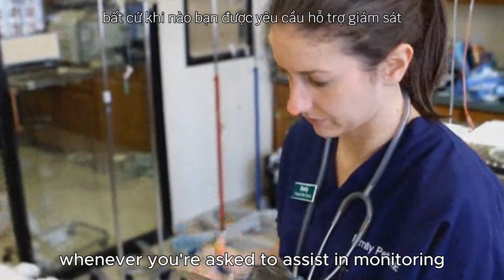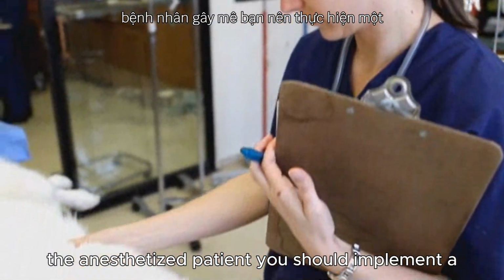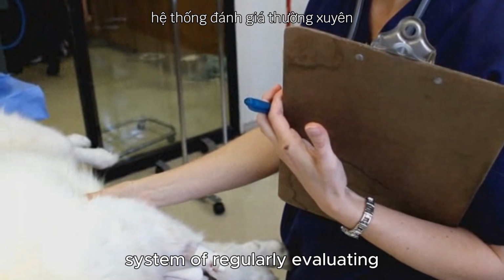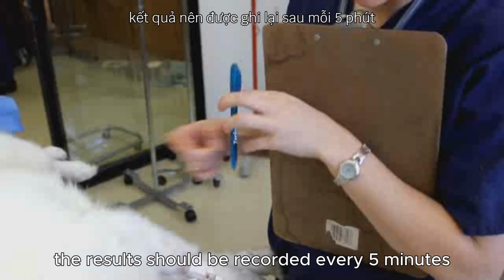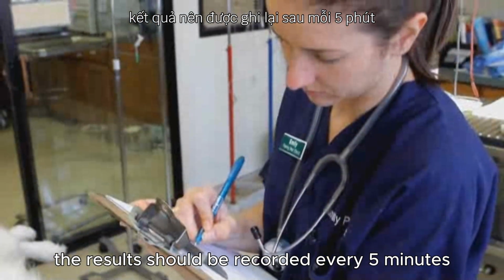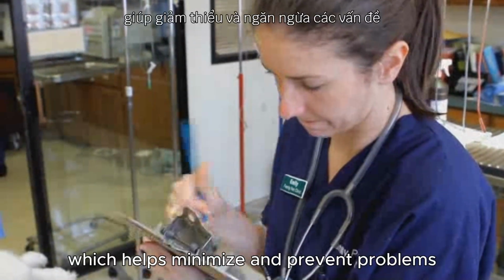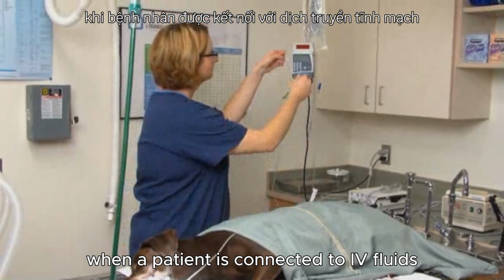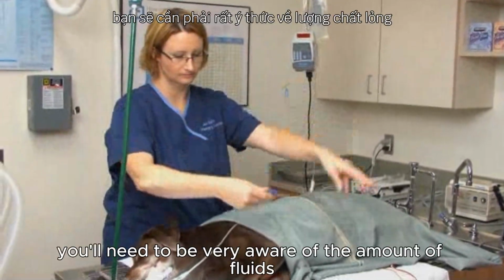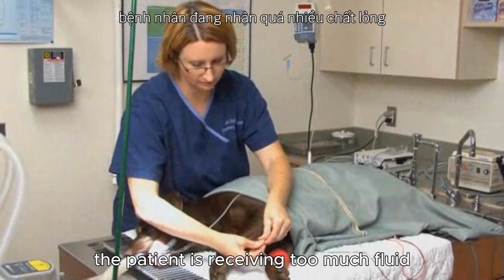Whenever you're asked to assist in monitoring the anesthetized patient, you should implement a system of regularly evaluating each of the variables being monitored. The results should be recorded every 5 minutes on an anesthetic record, which helps minimize and prevent problems. When a patient is connected to IV fluids during anesthesia, you'll need to be very aware of the amount of fluids the patient is receiving.